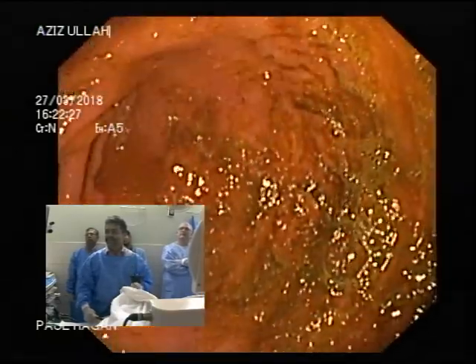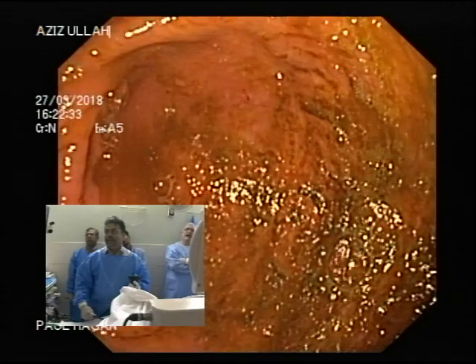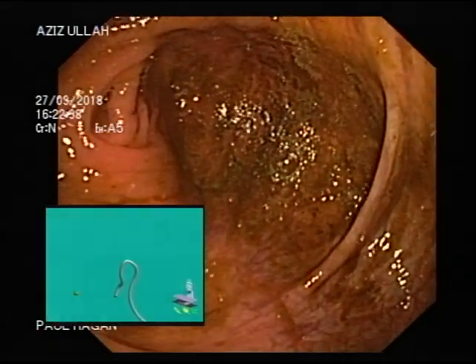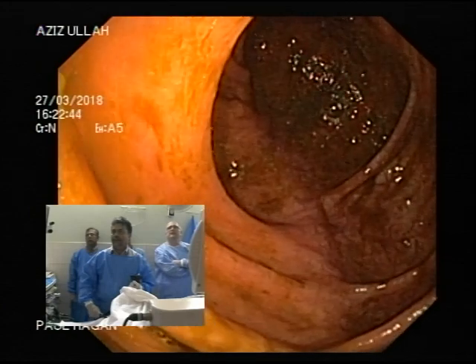Keep coming. Keep coming now, slowly, anti-clockwise. Come back. Come back. Come back. That's it. Now, slowly, anti-clockwise. That's the fold we want to go in.